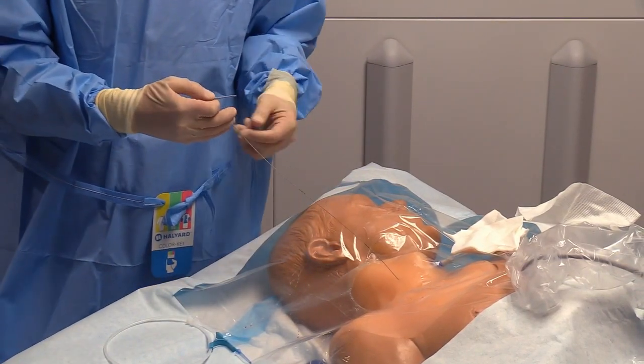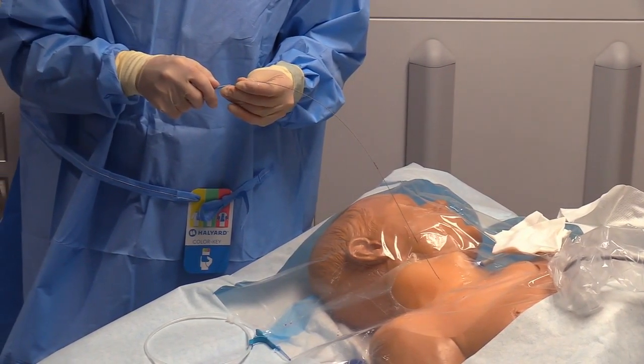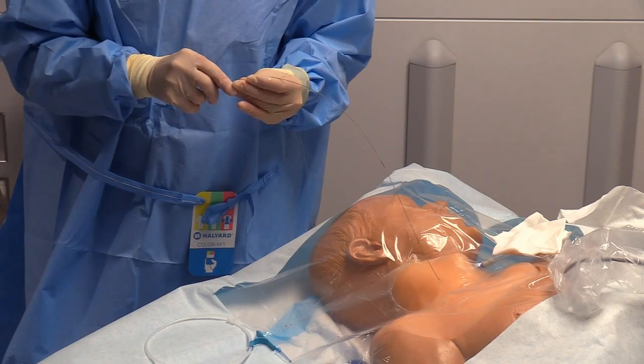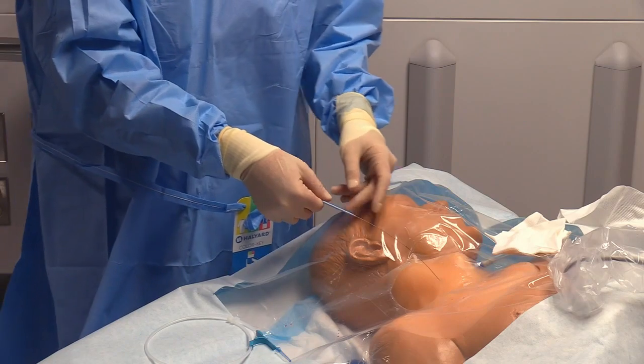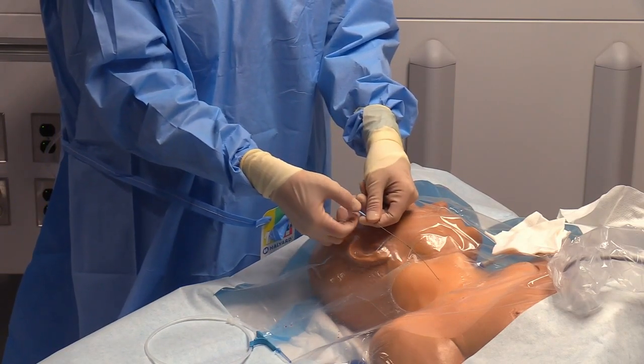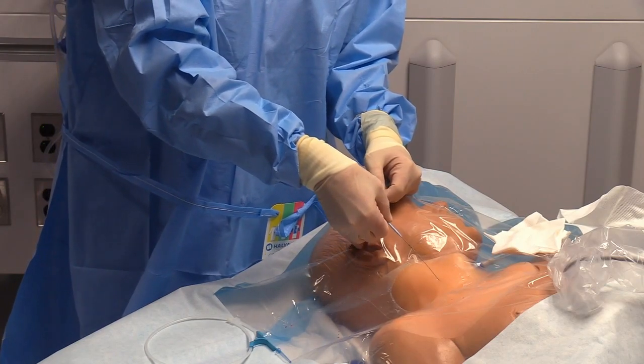The next thing that you want to do is, with the dilator, you want to pass this through. Now the wire should not move. The wire is just the tracks that the dilator is going to ride on. So you want to make sure that as you pass this in, the wire doesn't move at all. I like to grab the dilator close to the tip, and it's more of a push and a screw method as you go in.